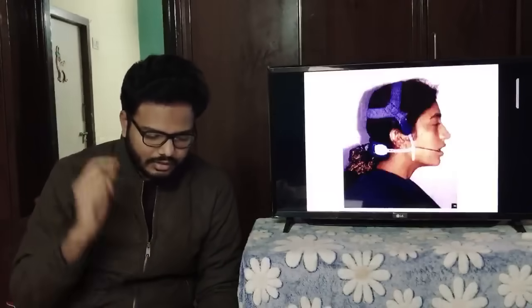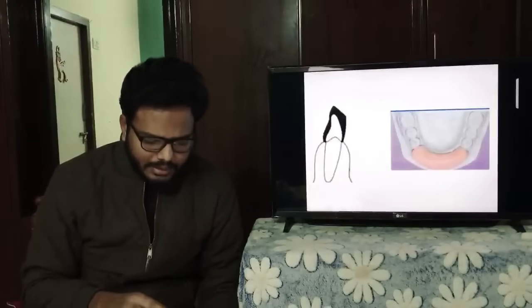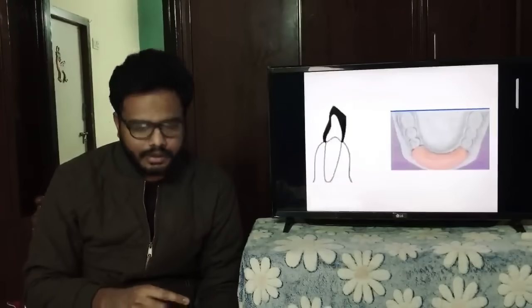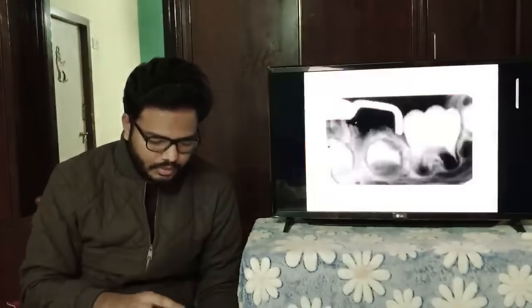Combination headgear, look into the picture carefully, right? Cervical as well as occipital straps. And this is Catlan's appliance or lower anterior inclined plane for correcting anterior crossbites. And this is the distal shoe, an intra-alveolar appliance.